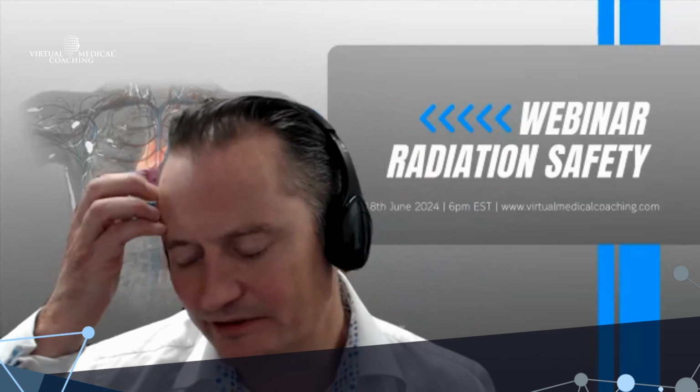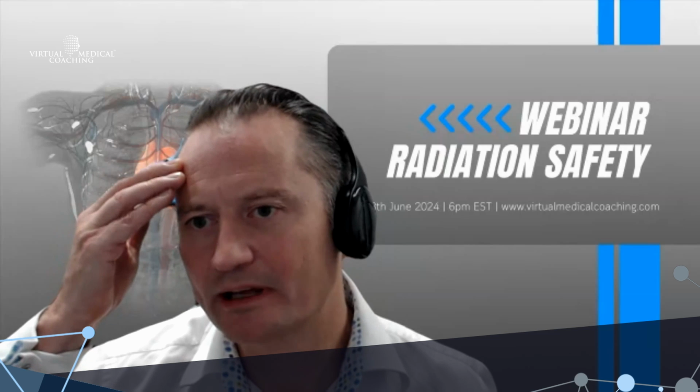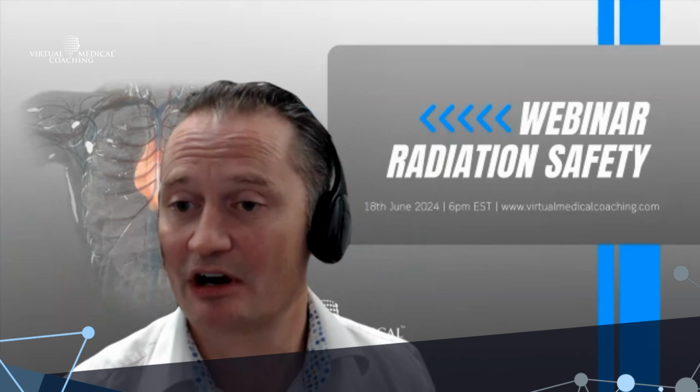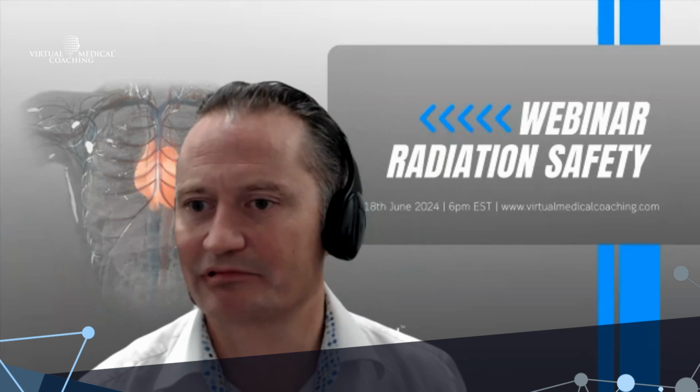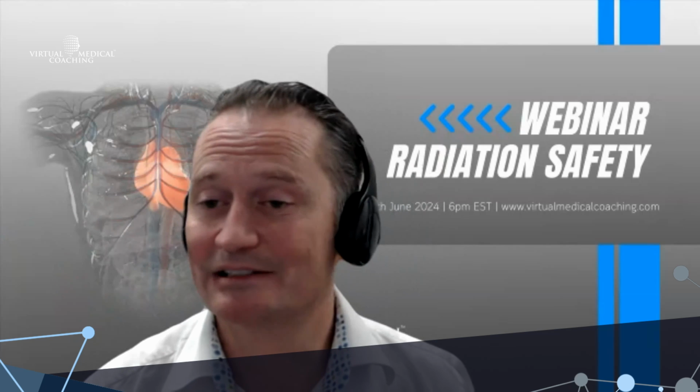Cool, thanks, Jason. And it's actually interesting. Both you and Shauna were talking about the tips of going through. In the second video that I've recorded, I want to show everyone what the radiation safety lessons are, and it does come up. It's about the distance of the detector from the patient, whether you've got your lead protection on, and then in your report you get these figures.